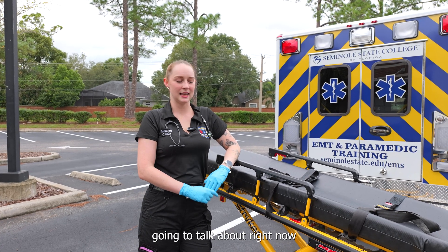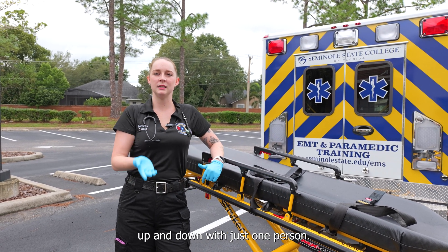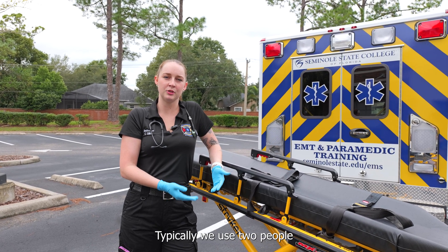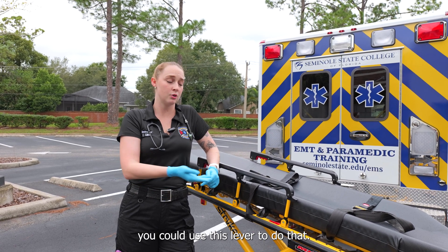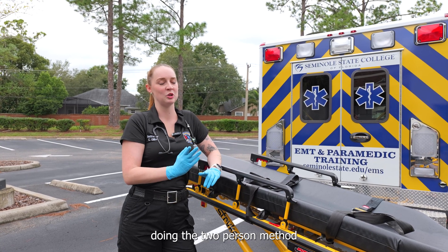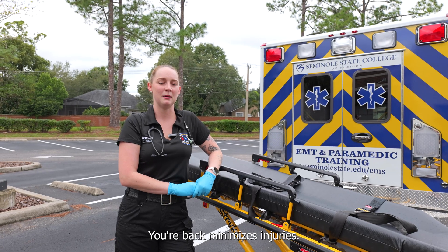The lever in this area can move the stretcher up and down with just one person. Typically we use two people to move a stretcher up and down, but in the event that you needed to do it by yourself, you could use this lever to do that. I would just recommend doing the two-person method as it's the safest for yourself and minimizes back injuries.